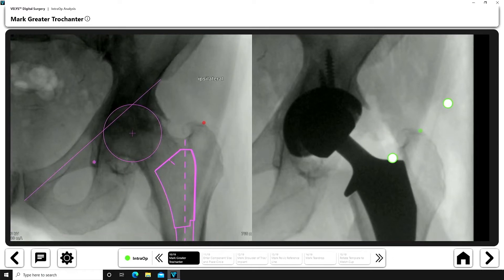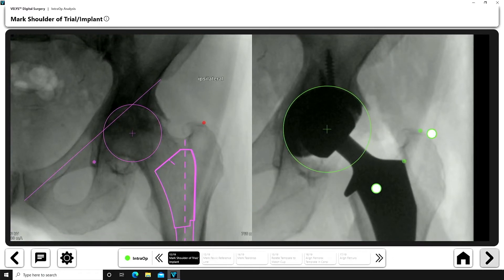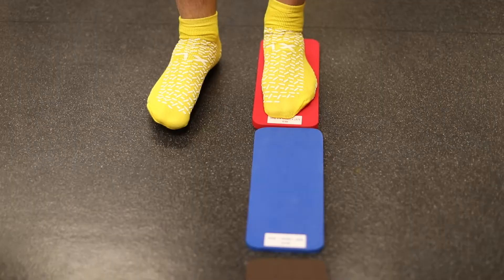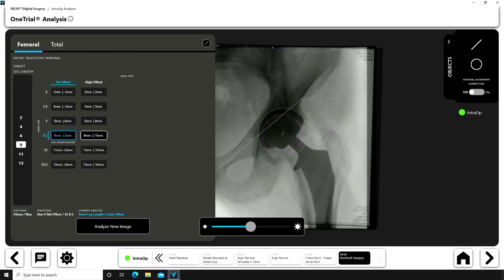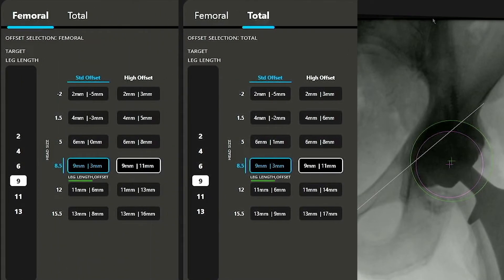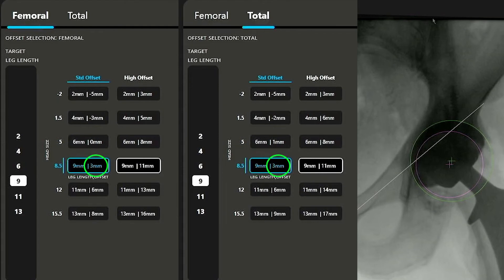Next, I ran the one trial against the ipsilateral hip without traction with the final stem in place. Before surgery, when the patient was standing on Coleman blocks, he felt that he was between 8 to 9 millimeters short, and therefore the goal number for this one trial would be a length number between 8 to 9 millimeters. The offset numbers are likely going to be positive as the femoral head has collapsed and the center of femoral rotation has medialized. Therefore, the offset numbers will differ from what would be seen on a native non-collapsed hip. With this one trial, his leg length is 9 millimeters and both femoral and total offsets are positive.